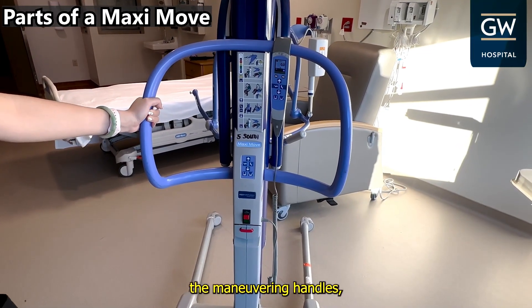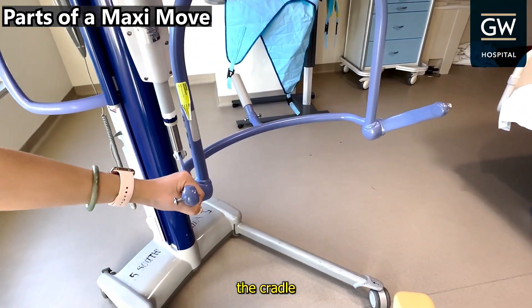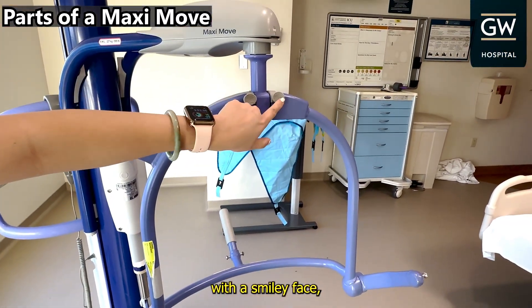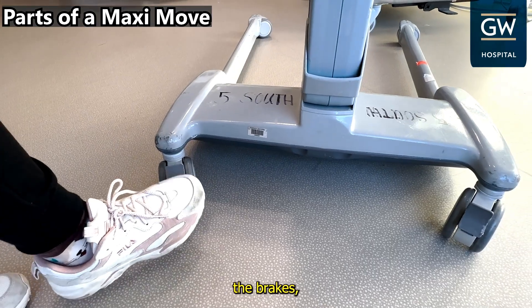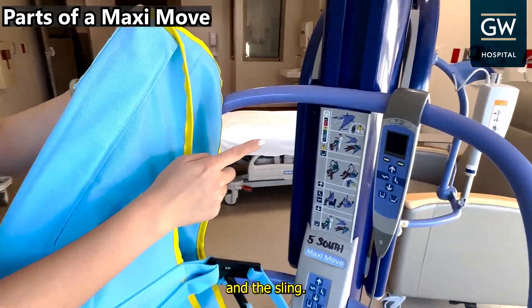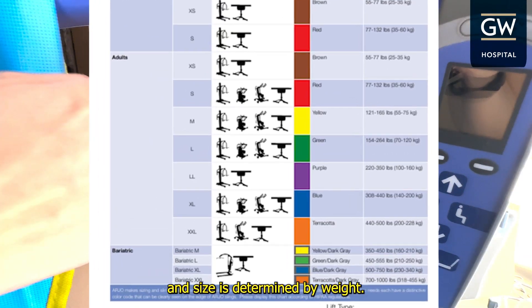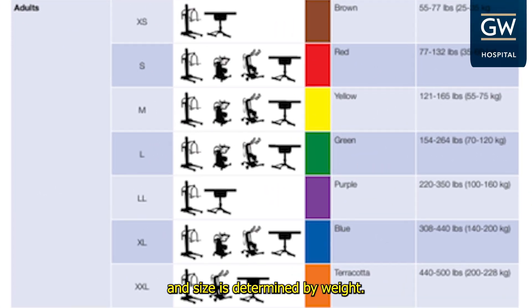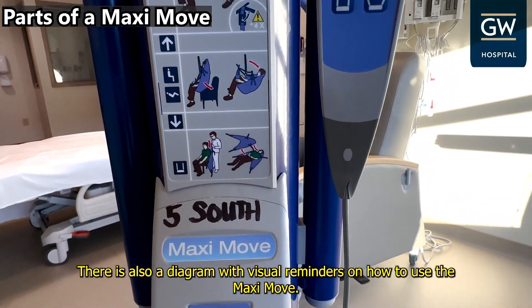The maneuvering handles, the cradle with the smiley face, four sling attachment lugs, the brakes, and the sling. The sizes correlate with the chart on the machine, and size is determined by weight. There is also a diagram with visual reminders on how to use the MaxiMove.